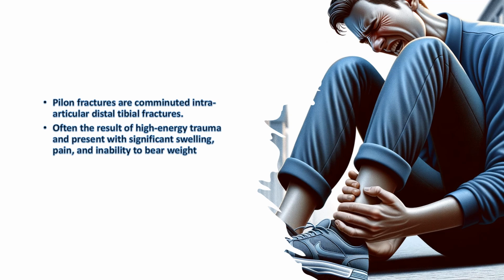AP, mortise, and lateral views of the ankle can delineate the fracture planes. A CT of the ankle is often necessary for complete characterization of the fracture planes, intra-articular fracture extension, and articular surface congruity.